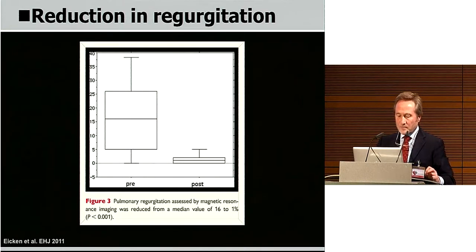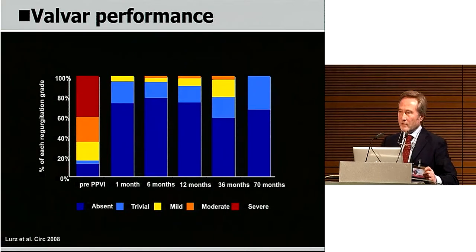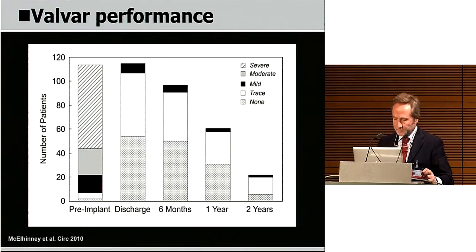This is a result from the German experience, almost no regurgitation after the procedure, and the same results can last during the follow-up. This is the long-term experience reported by Philipp Bonhoeffer some years ago in the preliminary London experience. So the Melody valve is competent in almost 100% of the cases during follow-up as well.